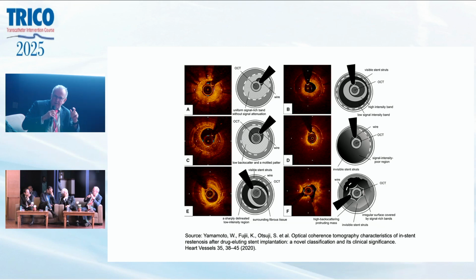But one of the key risk factors for subsequent occlusions or MACE was if the vessel actually had occluded during the intervention. And that was probably the most powerful one. And then it was really the degree of stenosis. These were just angiographic studies. There was no IVUS, there was no OCT. And in general, a lot of these dissections actually just healed themselves.